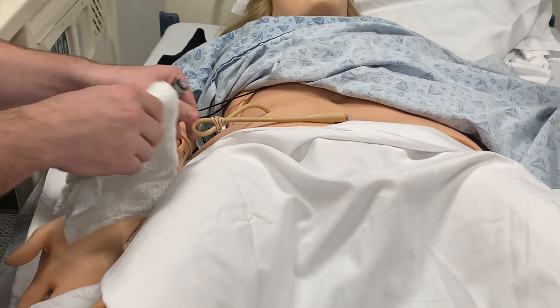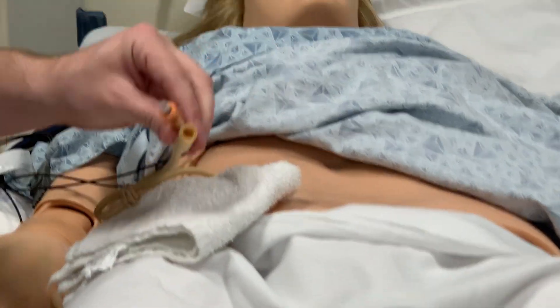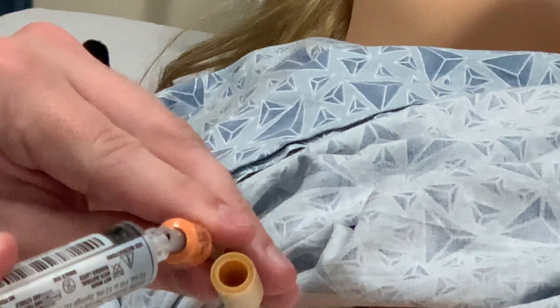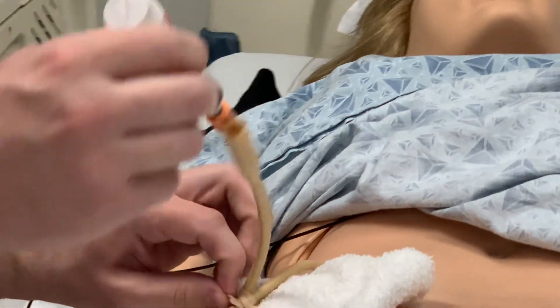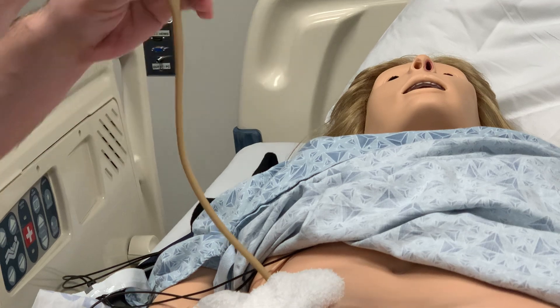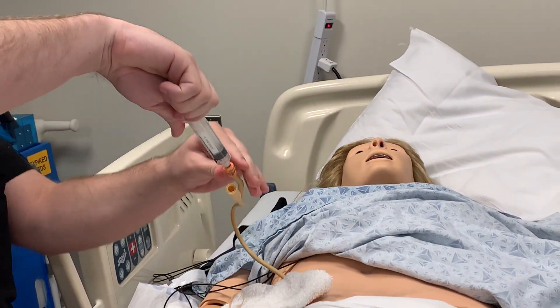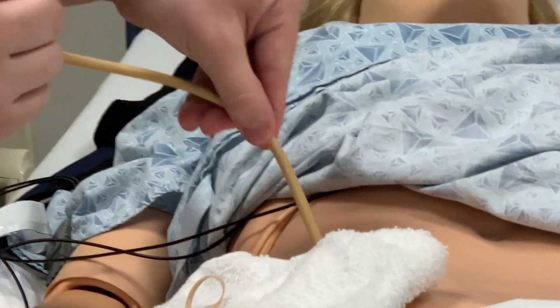The washcloth is just to clean up if we make a mess as we pull the catheter out. We will grab the catheter and place it vertically. We will attach our luer lock syringe to the balloon port, shown here, and rotate it on tight. We will then remove our clamp or rubber band. We'll pull back on the syringe until fluid fills it and no more fluid comes — then we'll unattach the syringe and smoothly pull out the catheter. We'll use the washcloth to clean up if needed.